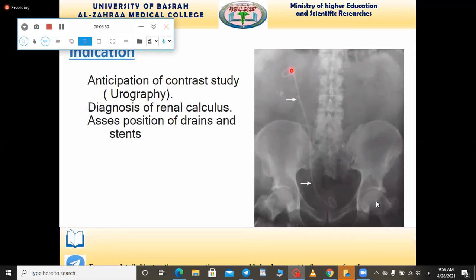Here is a ureteric stent. Please name it, كتبوها ملاحظة. Commonly, we call it a double J stent. Why double J? Because هو لازم يكون double مثل حرف الجي، لازم جي فوق وجي جوا، فيسموه double J stent، أو الاسم الثاني ureteric stent.